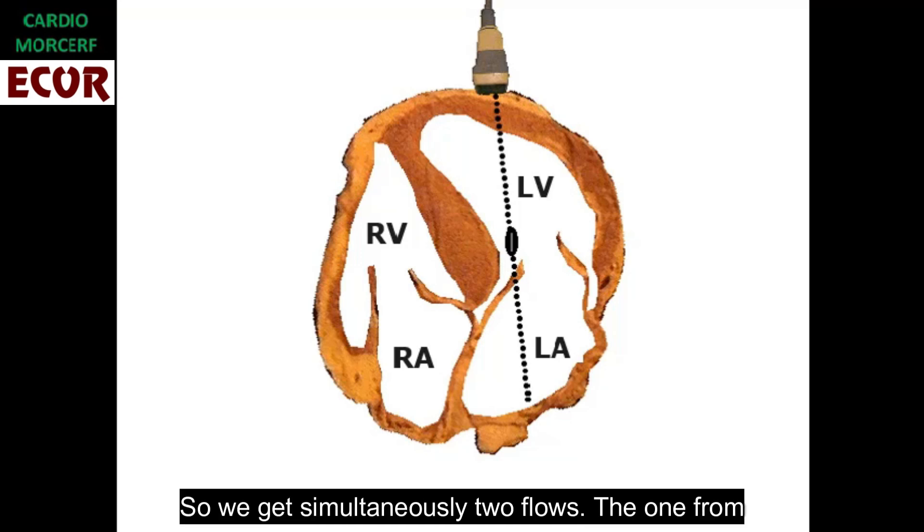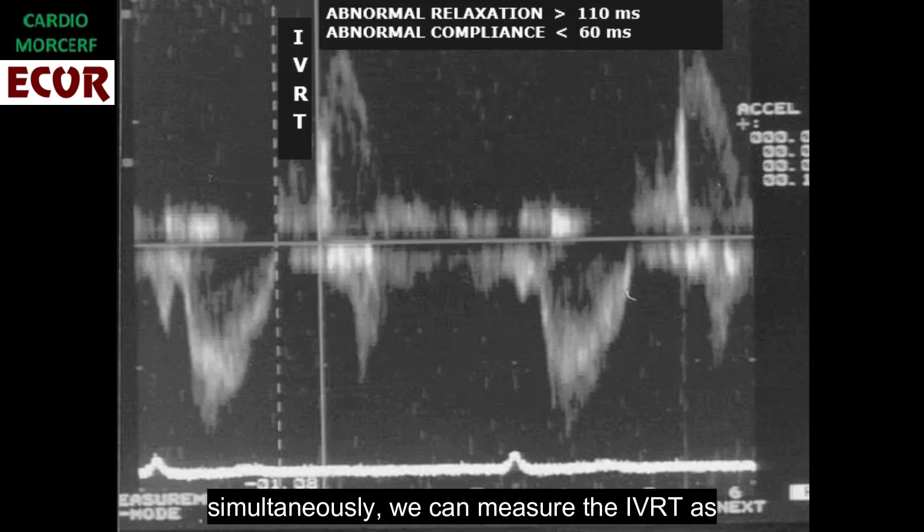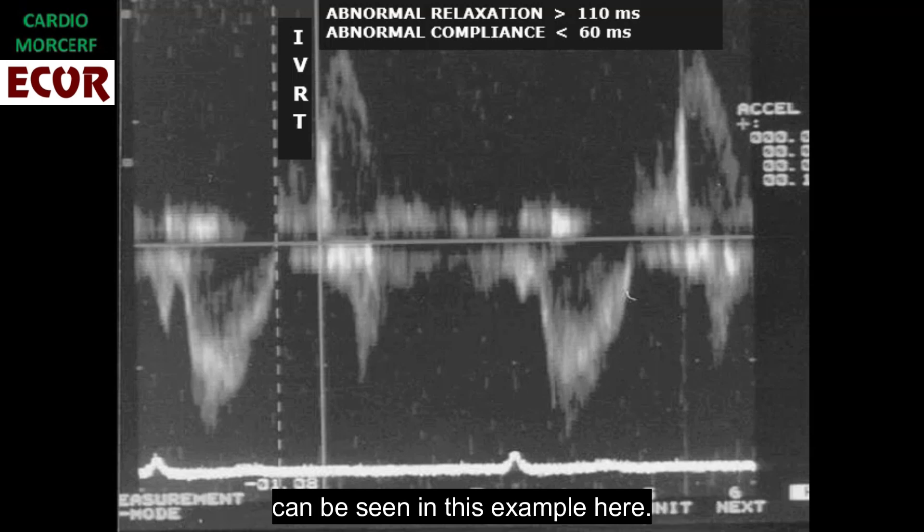So we get simultaneously two flows: the one from the left ventricular outflow tract and the other from the mitral flow. When we get these two flows simultaneously, we can measure the IVRT as can be seen in this example.